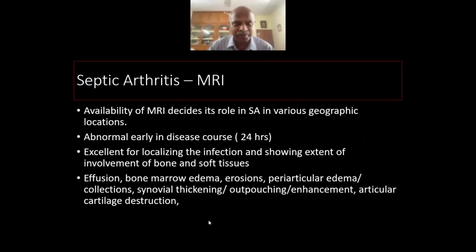arthritis. Let's now come to the imaging modality that's used most often, which is the MR. Fortunately, in our country, there's a good availability of MR, and there's not a very high waiting time for an MR appointment. Even in our second and third tier cities, MR is freely available, and that too with good equipment.